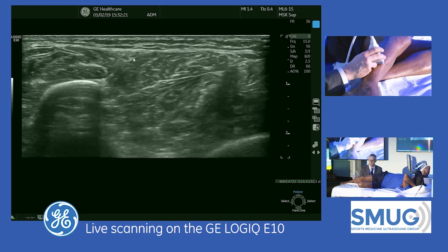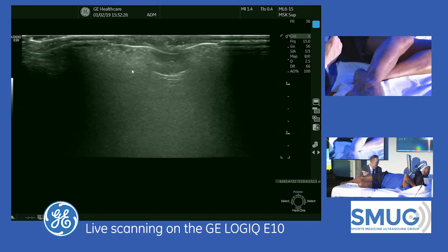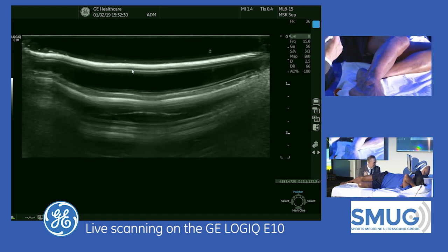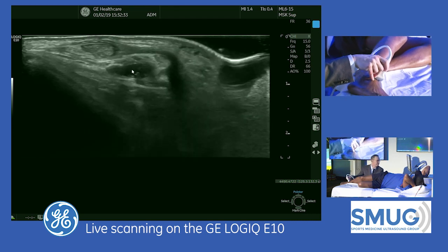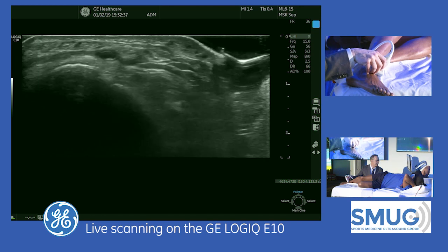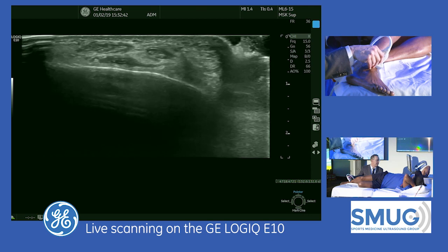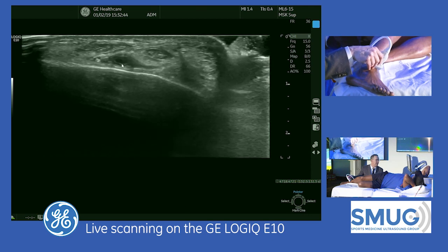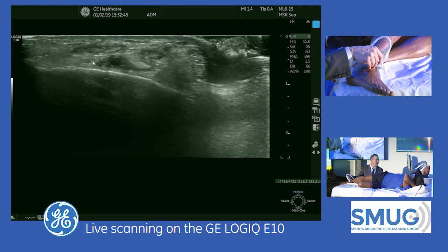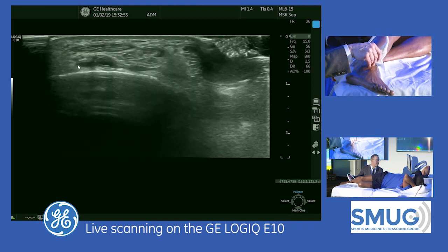That's the superficial branch of the peroneal nerve. The deep branch comes out anteriorly. To find it, we look at the level of the ankle joint and at the level of the tibia. Here we see the anterior tibial artery, which continues distally as the dorsalis pedis. Right next to it is the deep branch of the peroneal nerve — those are two landmarks for finding it.